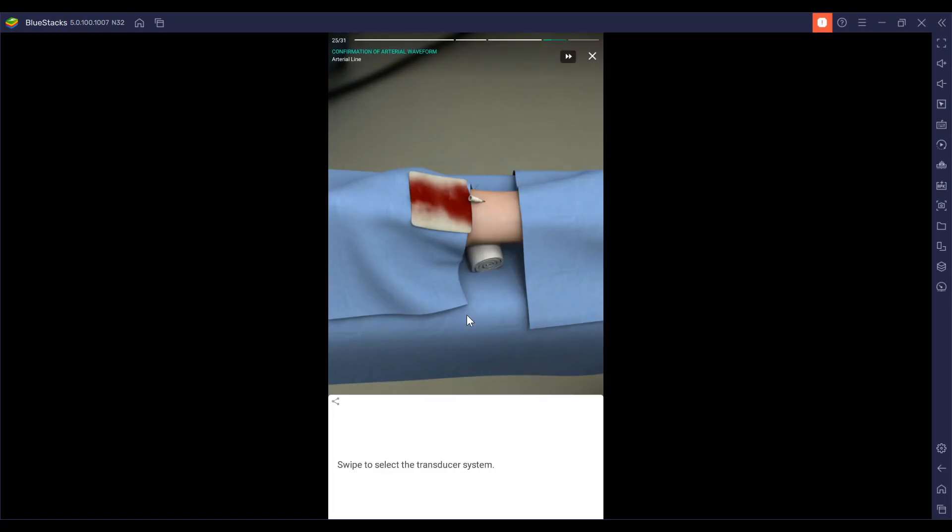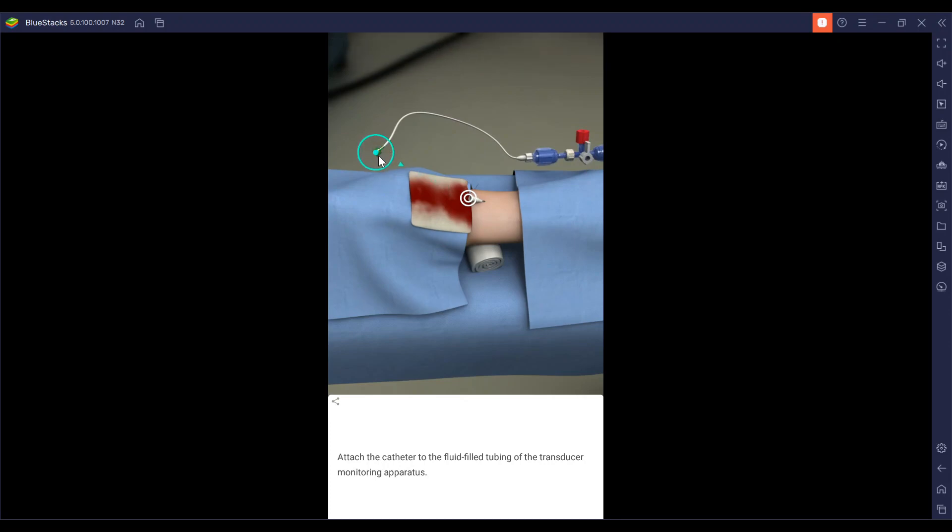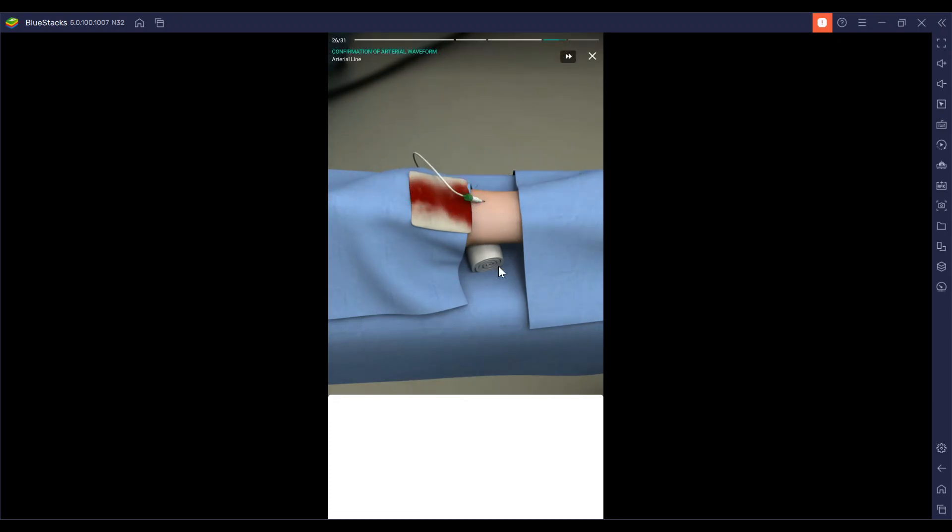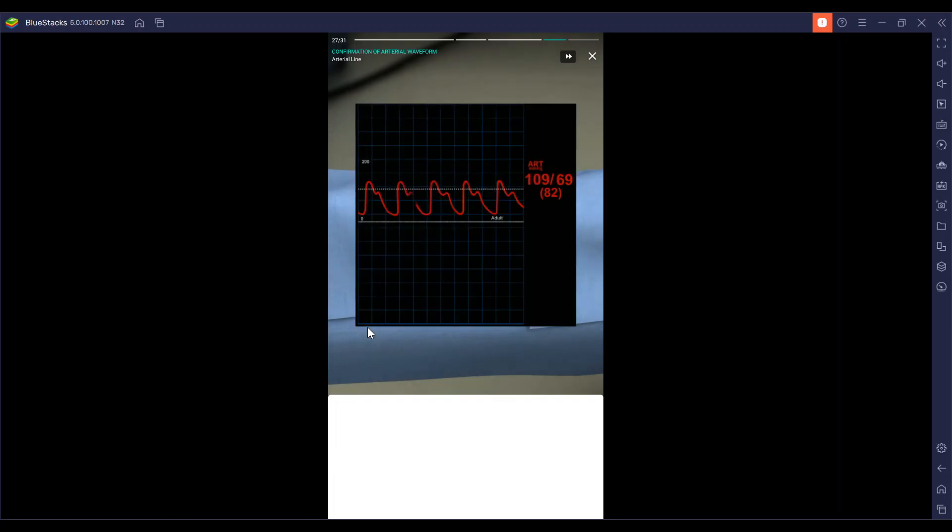We're going to use that transducer system and attach the catheter to the fluid-filled tubing of the transducer system, the monitor apparatus. This is where we will confirm a good arterial waveform on the monitor.